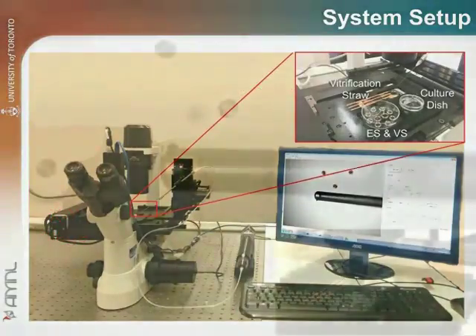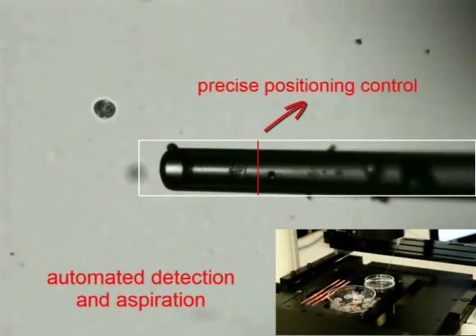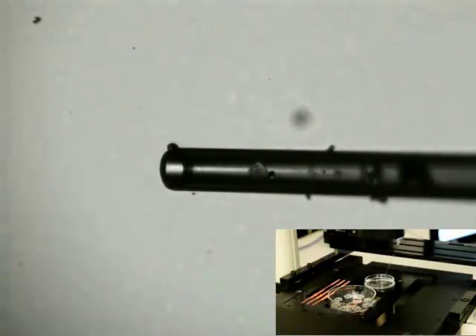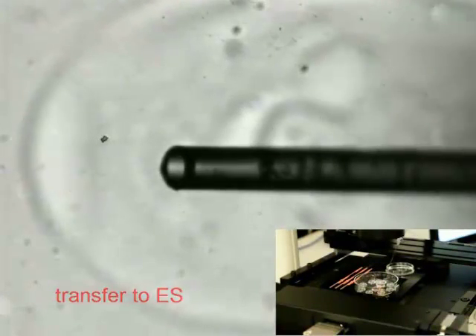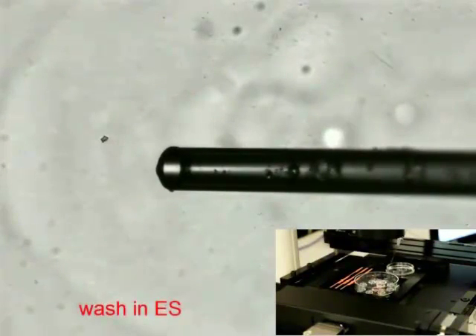After embryos are loaded and moved into the field of view, the system detects the embryos through image processing. The detected embryos are aspirated into the micropipette and then transferred into the equilibrium solution.